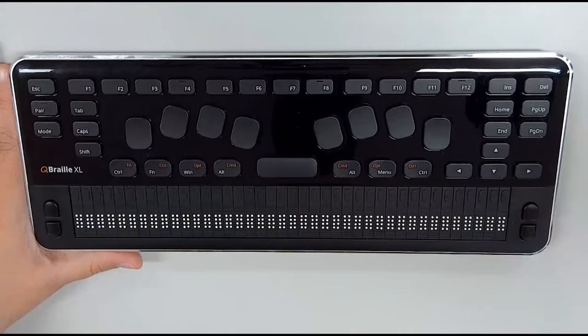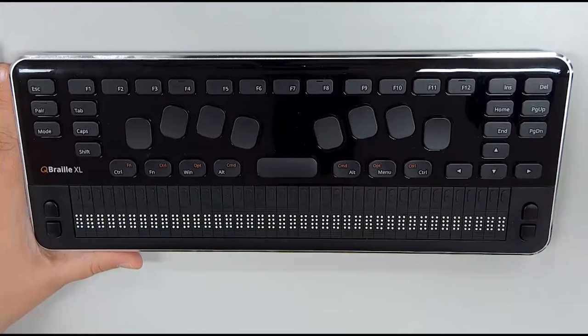So if we start on the same row as the space bar from left to right, we have Ctrl, Function, Windows, Alt, Space, Alt, Applications, and Control. To the right of that, we have a normal four-way arrow pad.